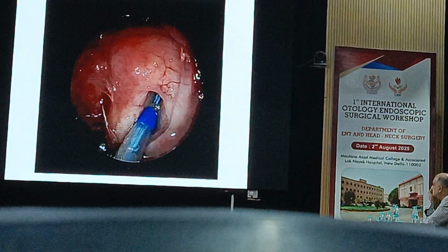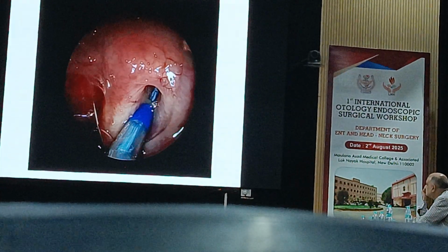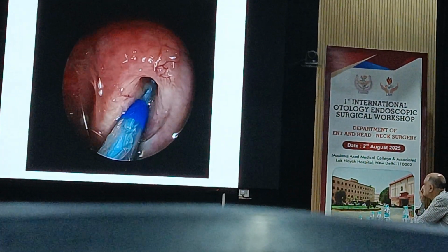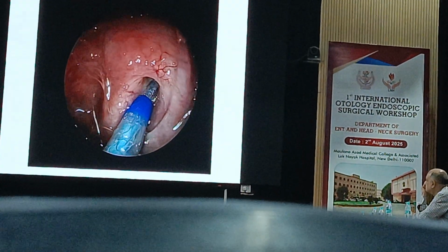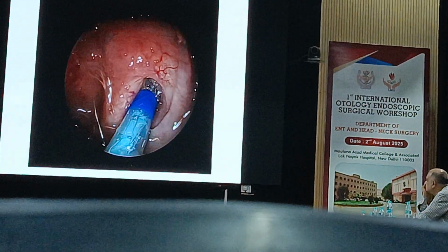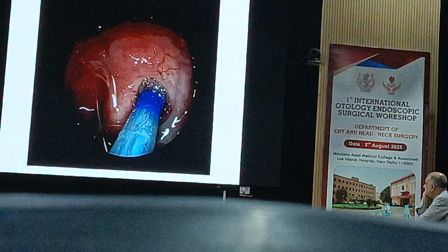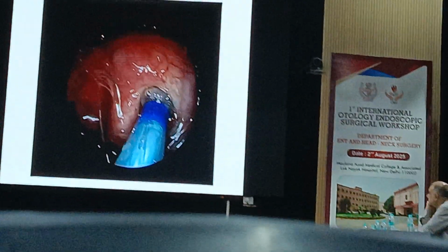It has a tendency to come back once you're dilating, so you have to hold on to the catheter. You see the balloon getting dilated inside, and you have to stay there for some time, as we have planned, like 90 seconds or 2 minutes, depending upon the eustachian tube score. Normal thing, nothing special about it, but you just have to be atraumatic and not go inside too much. And it works perfectly in most of the patients.